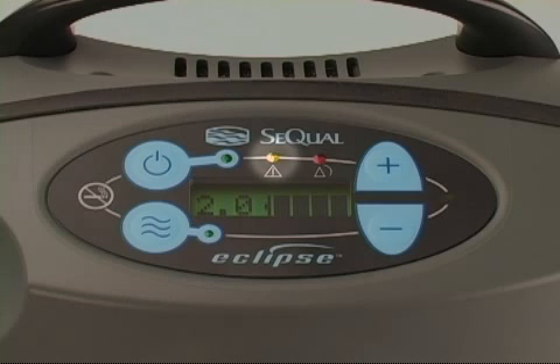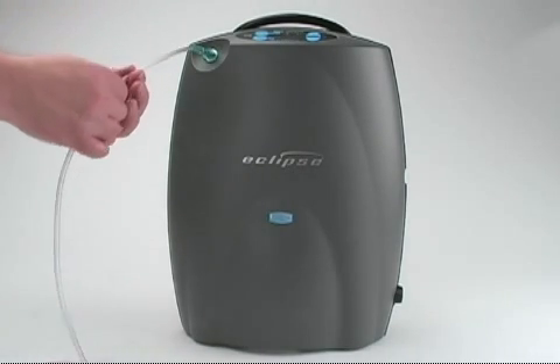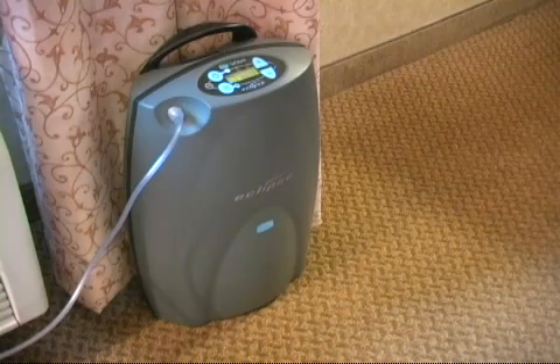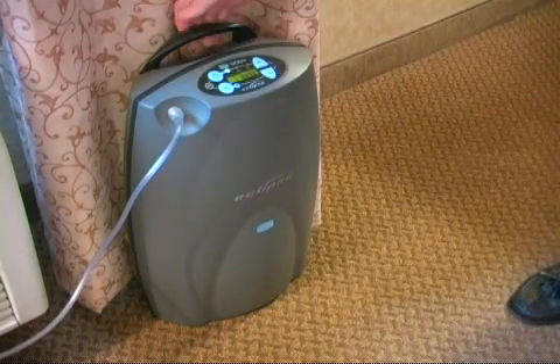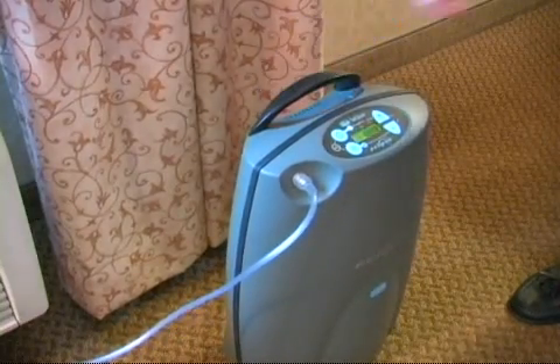If the flow of ambient air to the Eclipse II is blocked or the flow rate is reduced, an audible alarm will sound and the yellow indicator light will flash. Check your tubing for kinks and make sure the Eclipse II unit is located away from furniture, draperies, or other potential obstructions. If the condition persists, contact your home care provider.